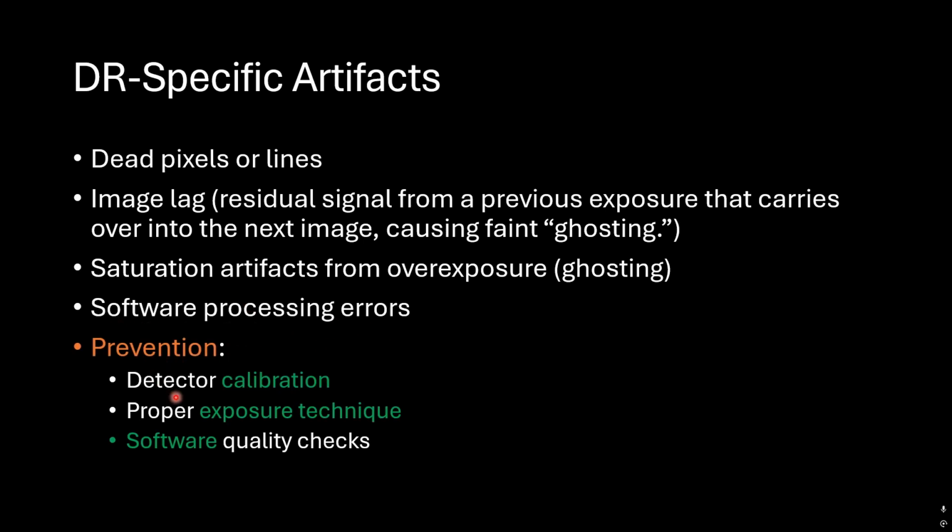So how to prevent that? Detector calibration is very important when we have such issues, and therefore we need to do recalibration of our detector or system, proper exposure technique, and software quality checks.